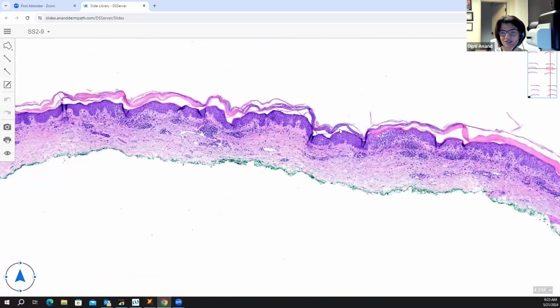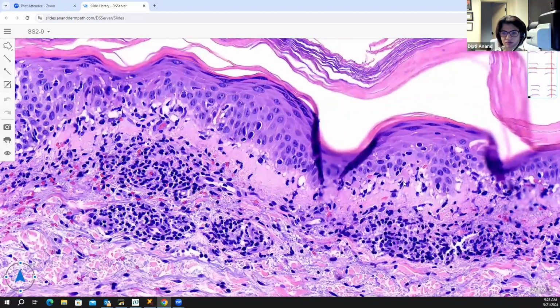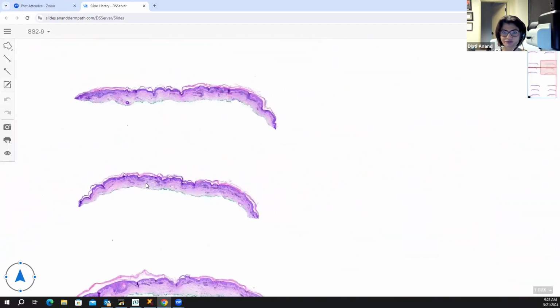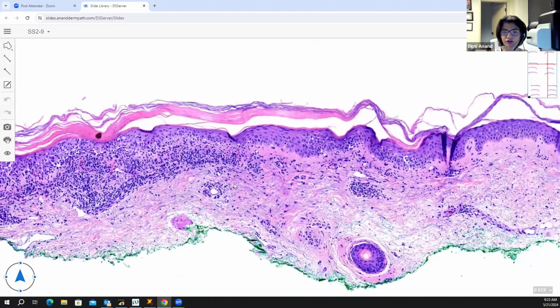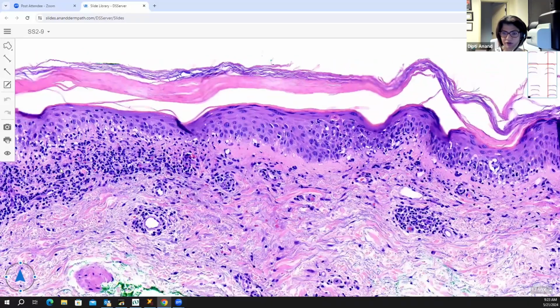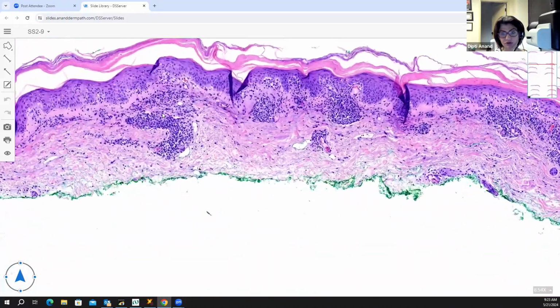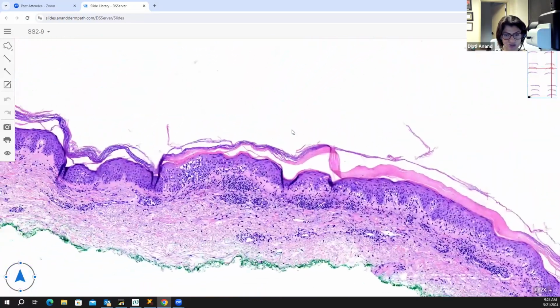There is hyperkeratosis, and you see how thick the basement membrane is? Yeah, I do see that thick basement membrane. So this is a chronic interface disease, and by definition, this would be what then? When you're dealing with a chronic process, you see the nice atrophy, the hyperkeratosis, the thickened basement membrane. Yeah, like some sort of connective tissue disease. Yep, lupus or dermatomyositis. And surprise, surprise, there's also mucin in this slide. So it's not all solar elastosis, there is mucin.